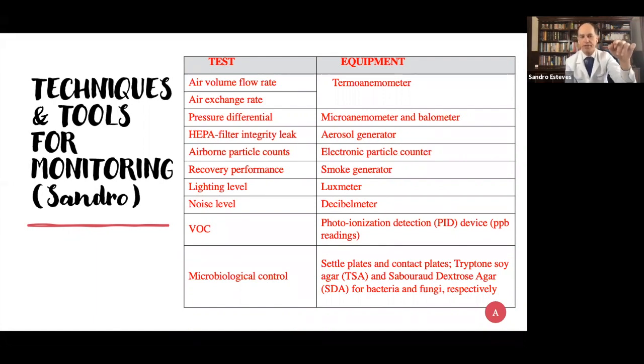Every time an embryologist or technician gets into the room, when they open the door, the system will automatically operate. You don't need to have the system on 24 hours a day because it's a waste of energy. But as soon as someone opens the door, the system starts to create negative pressure, and that is very quick. The oxygen monitor is important so that the oxygen is not too low, at a level where someone could faint.